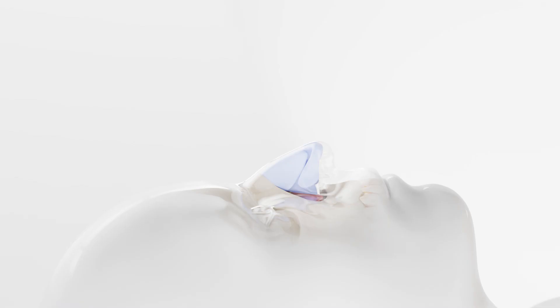To begin the procedure, plan proper placement based on the patient's anatomy. Mark the caudal edge of the maxilla and the area of collapse. Use the provided planning tool to mark where the implant atraumatic tip and forks will sit on the lateral wall.